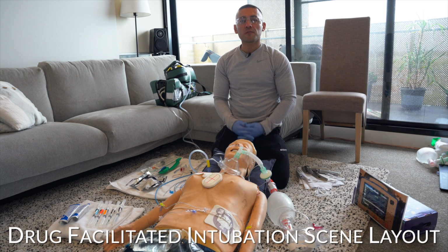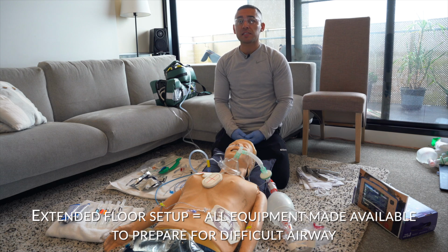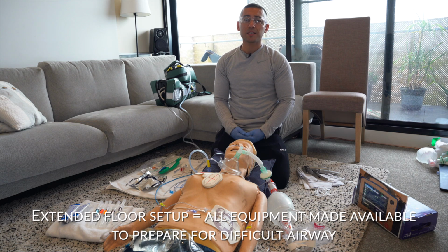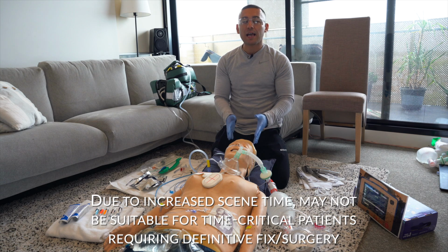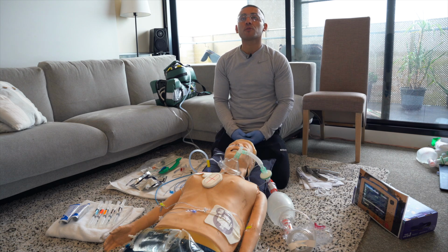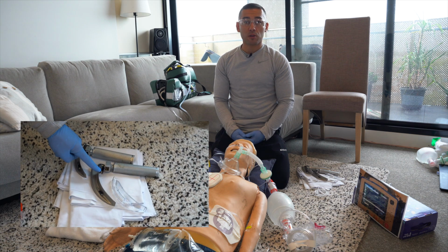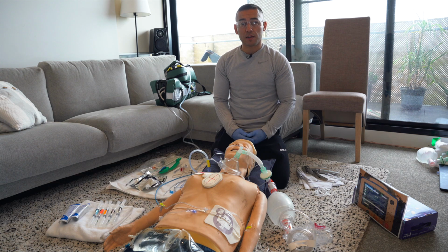The scene layout at a drug-facilitated intubation can vary significantly depending on a multitude of factors relating to the patient, crew, and environment. If a decision is made to intubate a patient on the floor, it may be appropriate to elect for an extended floor setup. As the extended floor setup involves so much equipment, it is important to lay the equipment out in a logical manner. Taking the perspective of the intubating paramedic at the head end, on the left-hand side should sit the laryngoscopes. There should be a size 3 and 4 Macintosh laryngoscope, as well as video laryngoscope. The reason for it sitting on the left-hand side is because laryngoscopy is performed with the left hand, thus making it easier to locate and pick up.